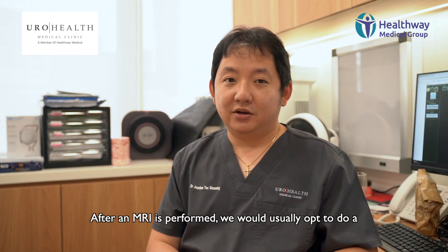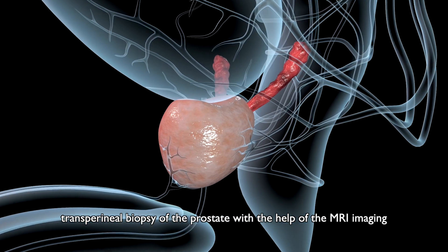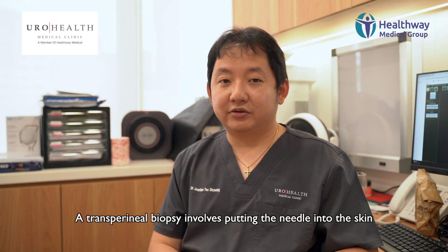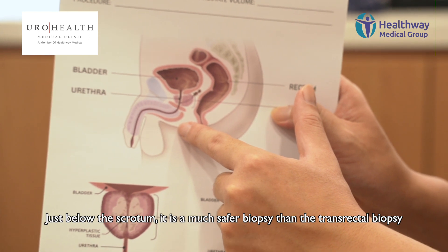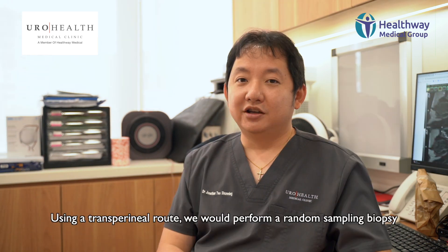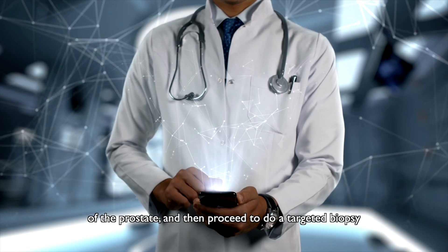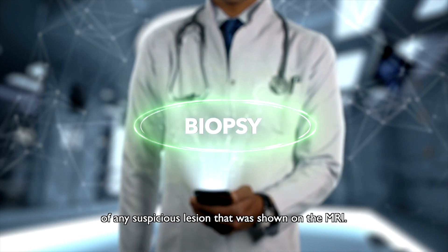After an MRI is performed, we would usually opt to do a transperineal biopsy of the prostate with the help of the MRI imaging, fused to the ultrasound images taken real-time during the procedure. A transperineal biopsy involves putting the needle into the skin just below the scrotum. It is a much safer biopsy than a transrectal biopsy in terms of infection and bleeding. Using a transperineal route, we would perform a random sampling biopsy of the prostate, and then proceed to do a targeted biopsy of any suspicious lesion shown on the MRI.